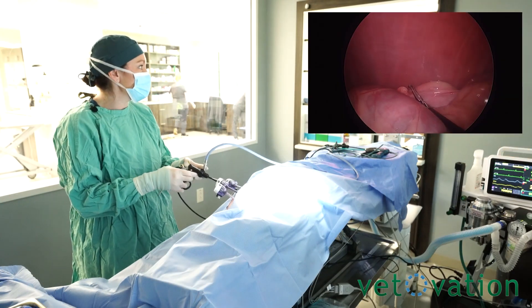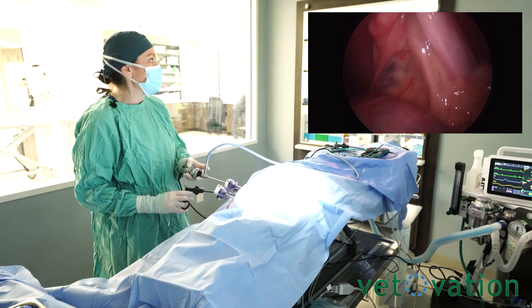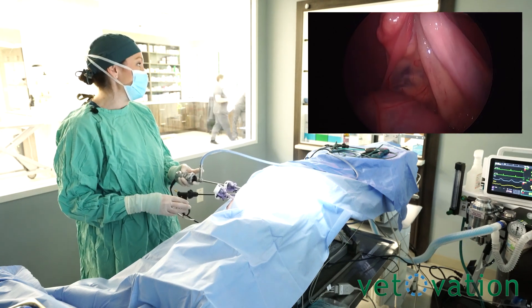If your organs don't flop out of the way, you're just wanting to make sure that you're taking atraumatic graspers in there to kind of move your essential organs out of the way.